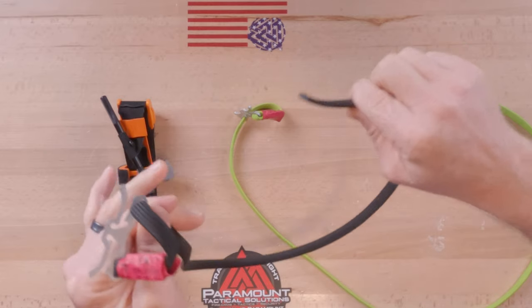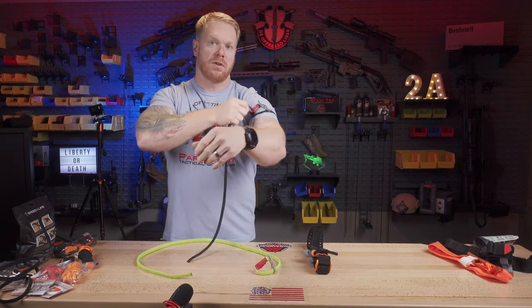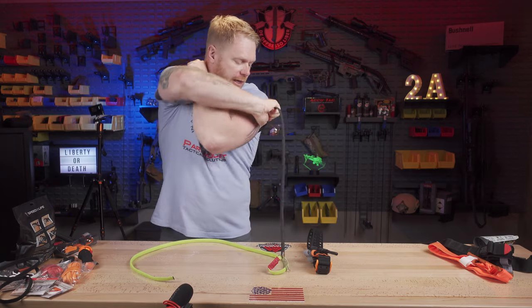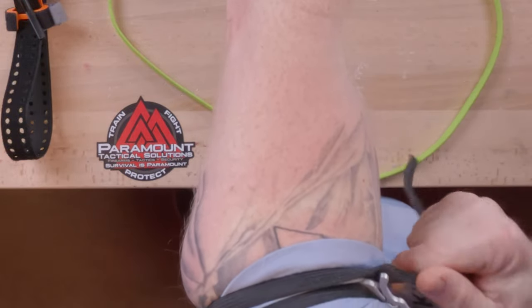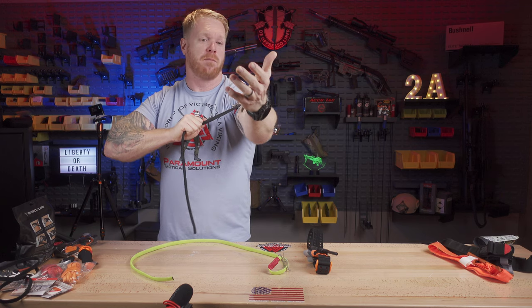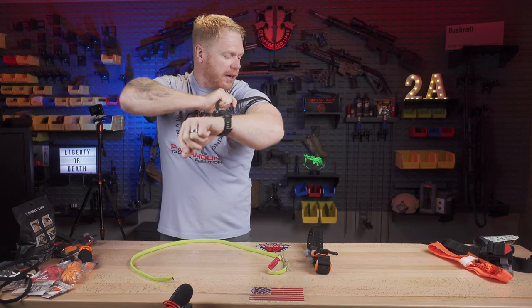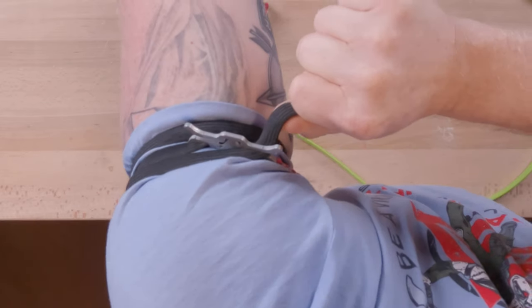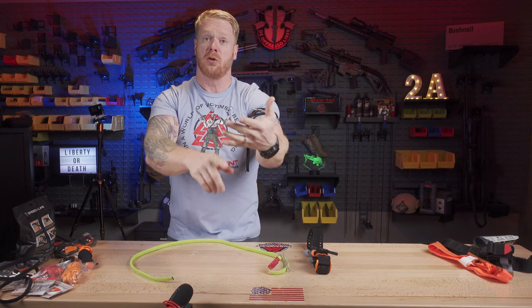Basically, what you do is take the free-running end and stick it through that three-finger loop. It doesn't matter which way you put it on. Once it's on, you pull away from that three-finger loop and wrap. Keep those wraps close together — you don't want them crossing over or spreading way out. With just one wrap, I've probably already got a full tourniquet. If it's not a full tourniquet, blood flow has stopped going down my arm dramatically. A second wrap is beyond a full tourniquet. Then just slide the end under that little cleat, and you have it tied off — a full tourniquet, very quick, simple, and easy.